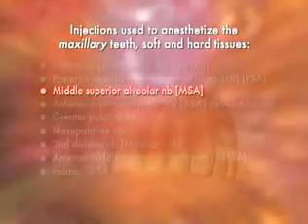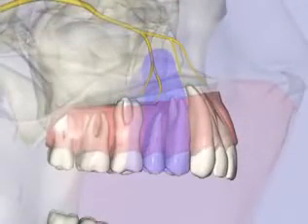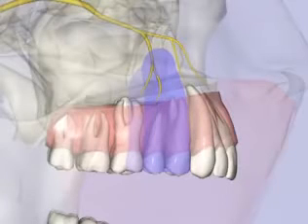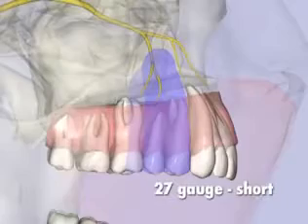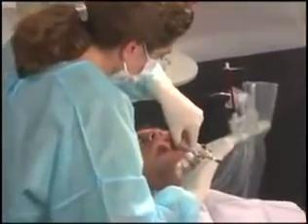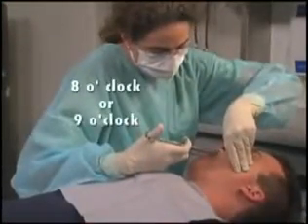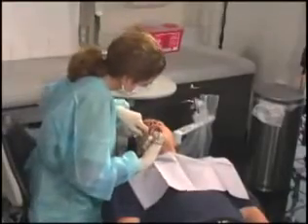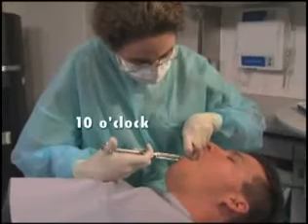The middle superior alveolar nerve block provides pulpal anesthesia to the maxillary premolars and the mesial buccal root of the maxillary first molar. A 27 gauge short needle is recommended. For the left MSA nerve block, the right-handed operator should face the patient directly from the 8 or 9 o'clock position. For the right MSA nerve block, a right-handed operator should face the patient from the 10 o'clock position.